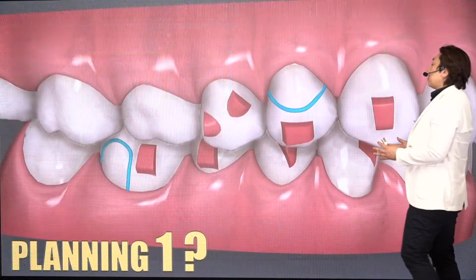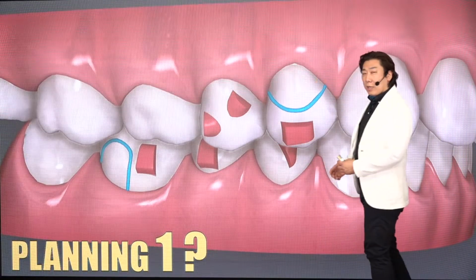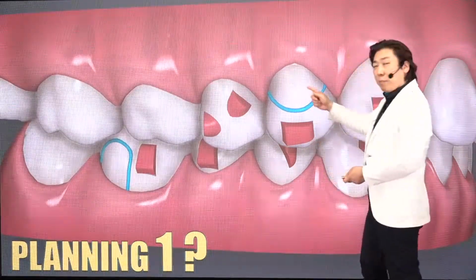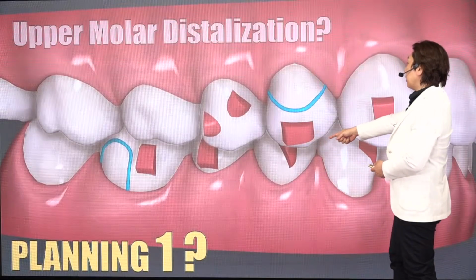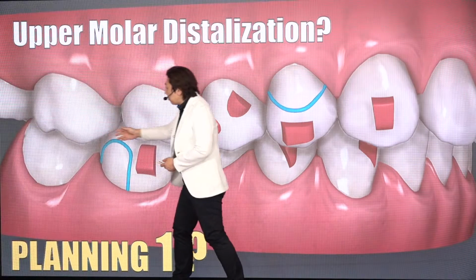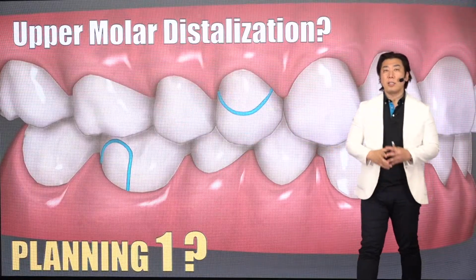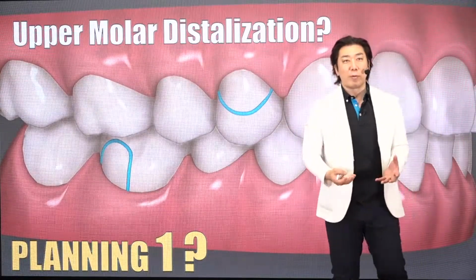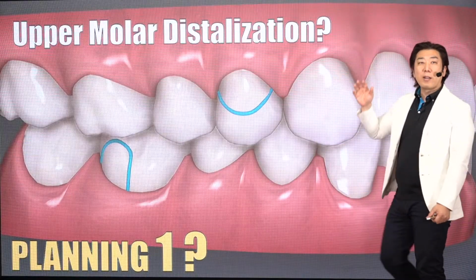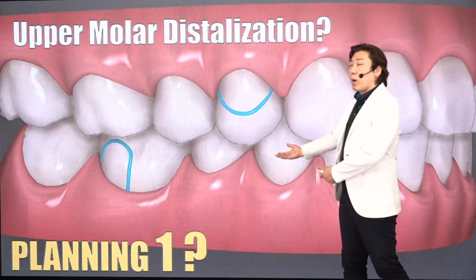My planning: what is a good solution? Please think about this. If a class 2 patient comes to your clinic, many doctors think about upper molar distalization. This is planning one. Upper molar distalize, second molar distalization, first molar distalization. This is a sequential tooth movement. This is the traditional approach for the class 2 patient. Then after that, canine retraction, finally anterior retraction. Is this good or not? This is planning one.